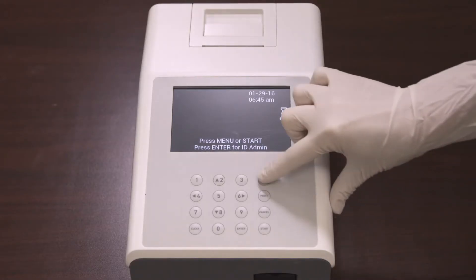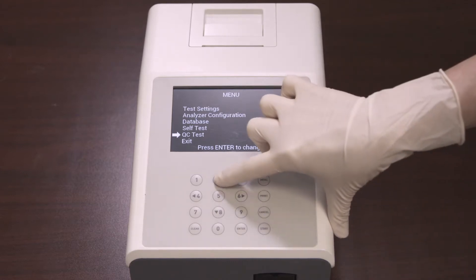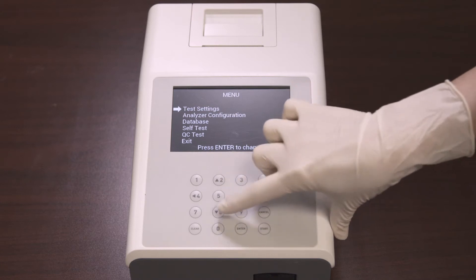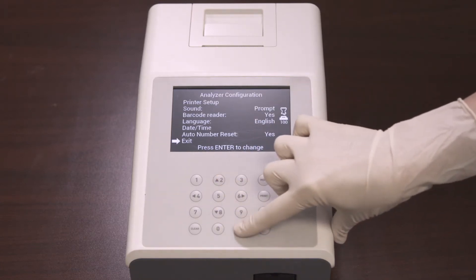Press Menu from the initial screen to access the test settings, analyzer configuration, and QC test. Use the up and down arrows on the keyboard to move along the menu. Press Enter to select an item on the menu. This is true for all menu screens.